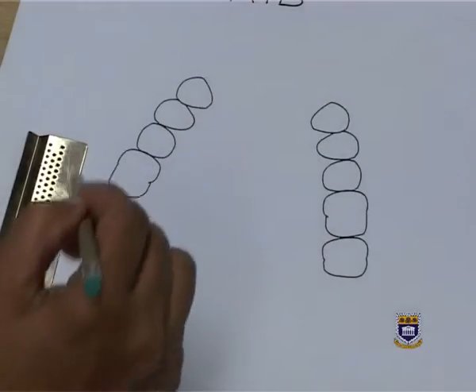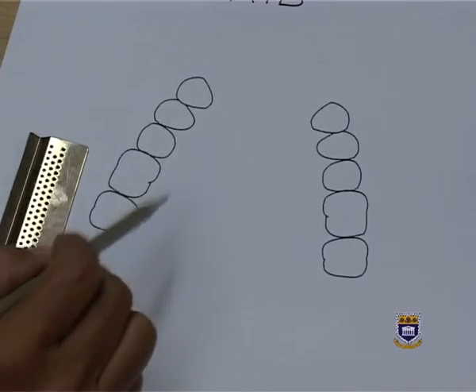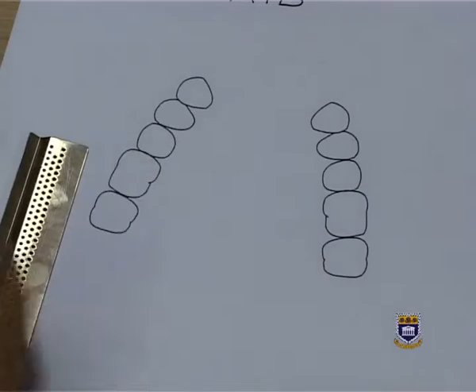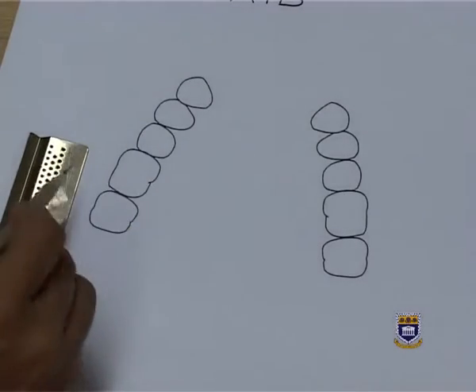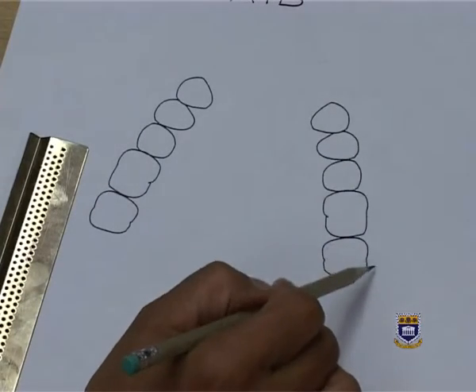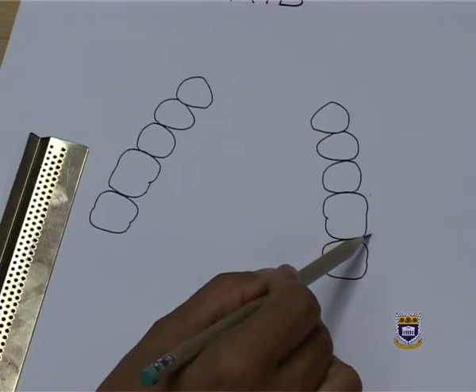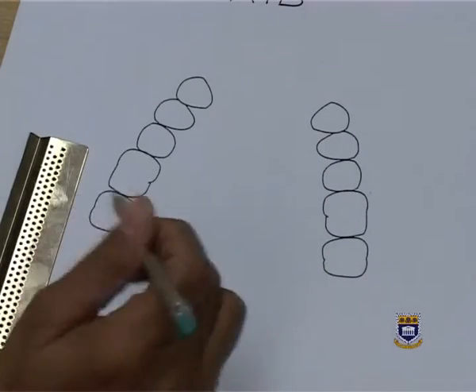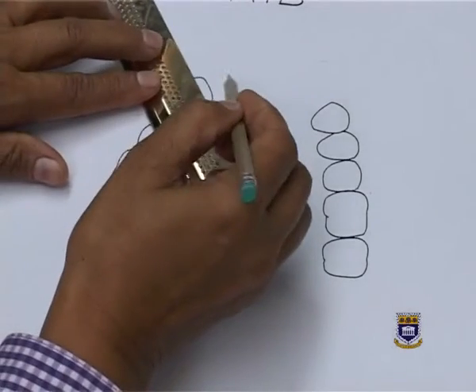Now at this stage we would have surveyed our model, we would have drawn our teeth according to our model, and remember this is a two-dimensional view of something three-dimensional. The first thing we do after we've surveyed, we have identified where all our undercuts are, and we would have put it on the teeth, whether it's buccal, mesial, distobuccal, palatal. All of these would have been added while we were doing surveying, and we would have done our guide planes.